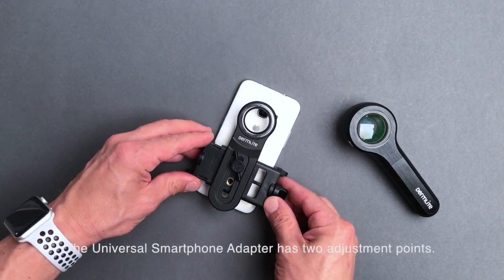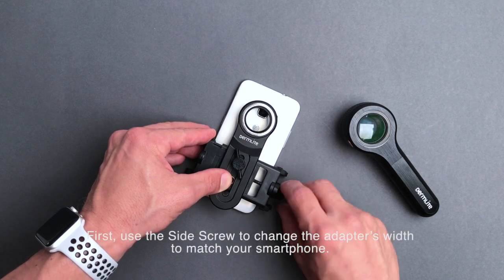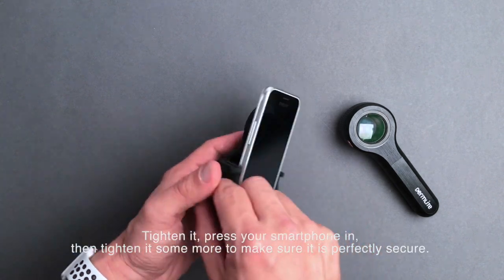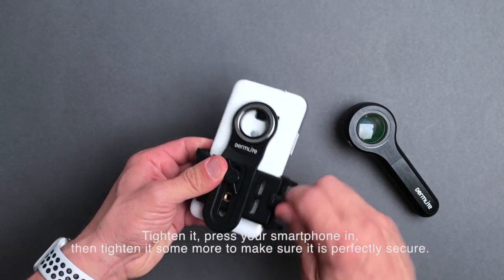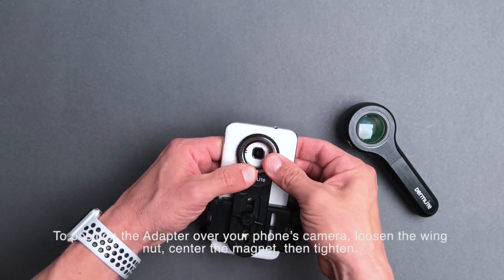The Universal Smartphone Adapter has two adjustment points. First, use the side screw to change the adapter's width to match your smartphone. Tighten it, press your smartphone in, then tighten it some more to make sure it is perfectly secure.